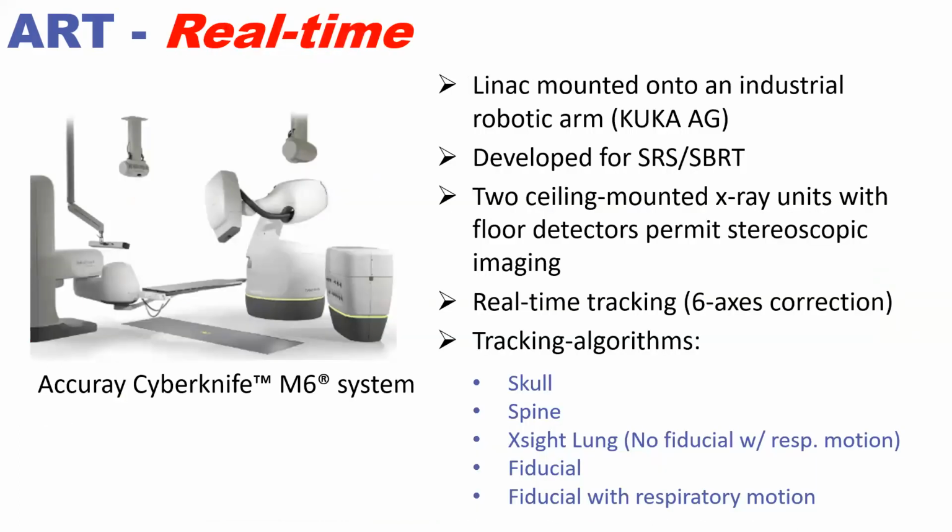So on to real time. Now we're on to the product, which is called Synchrony on the RadExact platform. For those of you who know it, Accuray produces CyberKnife, and CyberKnife is nothing other than really a Linac mounted onto a robotic arm made by KUKA. It was developed by a neurosurgeon for intracranial SRS, and then it's worked its way into the SBRT world.